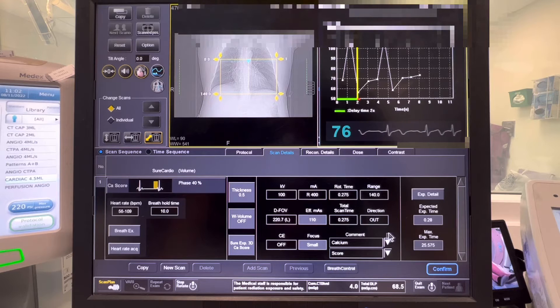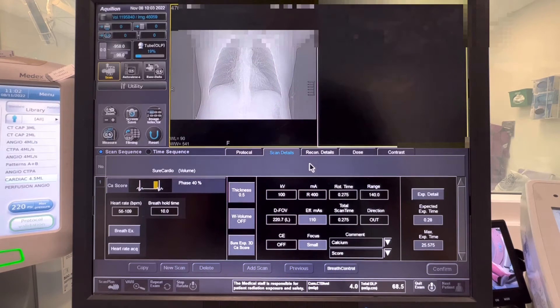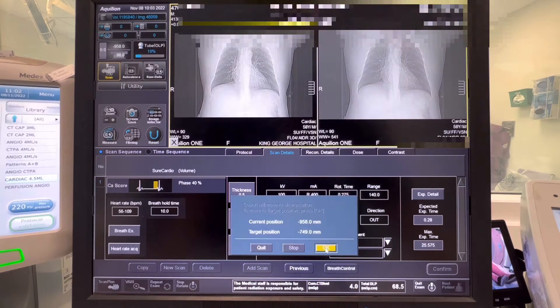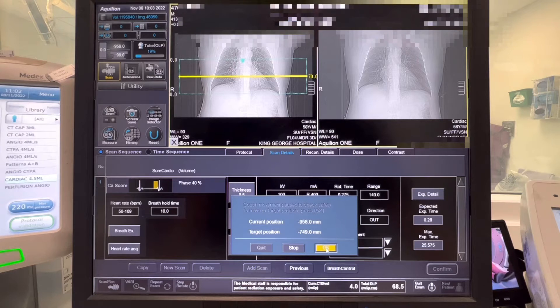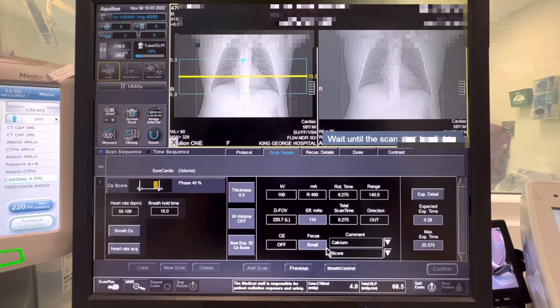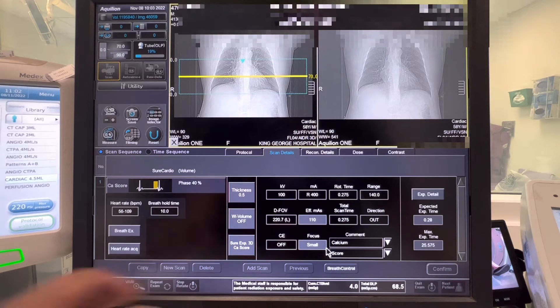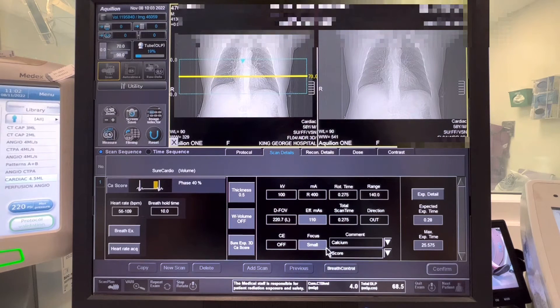After you've done the breathing exercise, press confirm and proceed with the calcium scoring scan. After the calcium scoring, the cardiologist will decide if the calcium score is within the range to proceed with the cardiac scan. For our patient, the cardiologist said it's okay to proceed with the CT coronary angiogram.